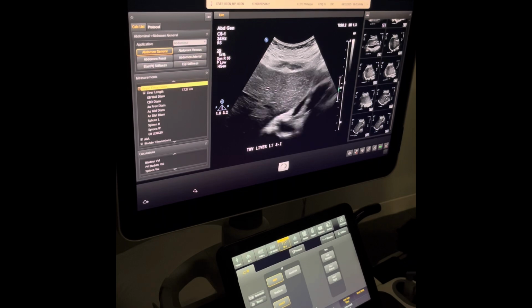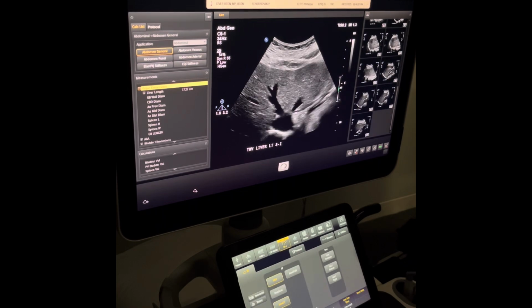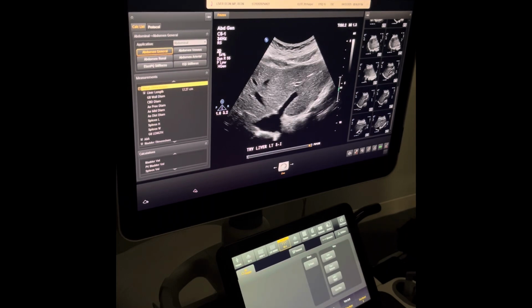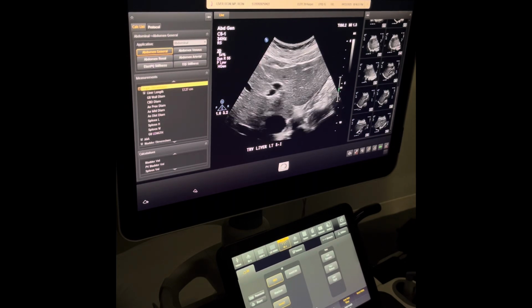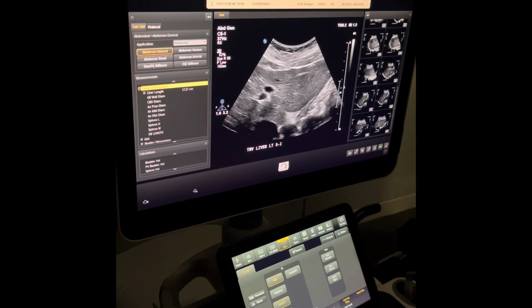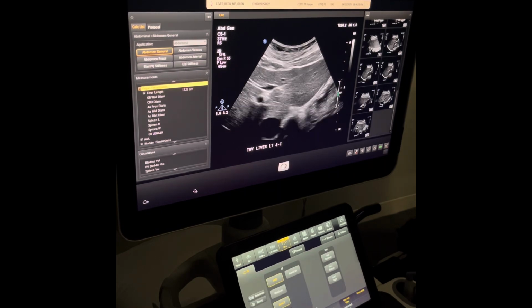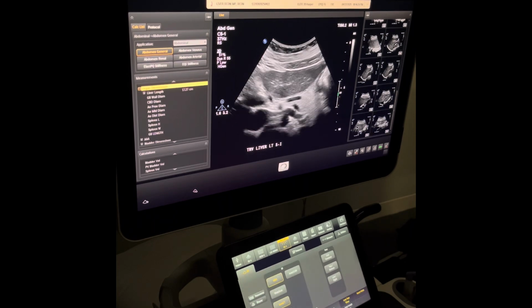This will be my first image, starting outside of any vasculature, sweeping down to the hepatic. And then down to the level of the portal vein. I'm cutting a little more depth. Then again, about every 2 centimeters until we're out of the tissue.